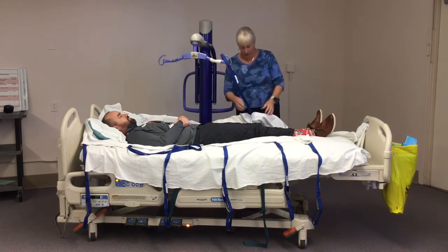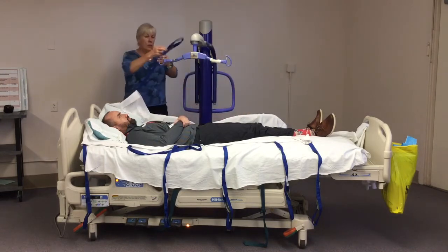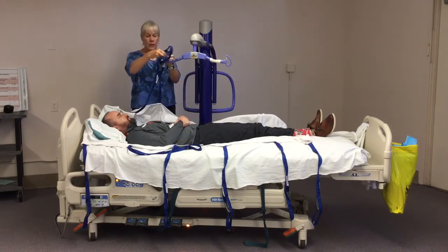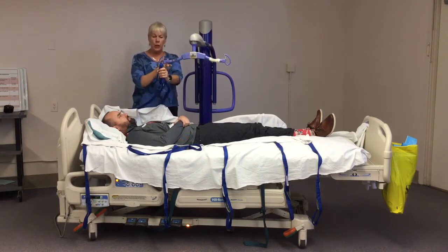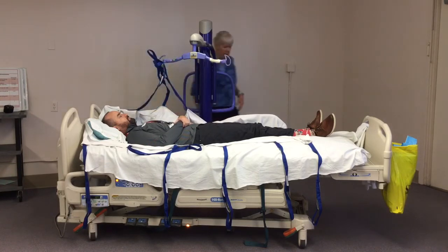The other thing, okay? Starting from the top, let's try, and you're going to use all the same color when you're doing this technique. Make sure that those loops are in there very good. Make sure that this is secure. Again, you do the same thing. You start at the top, move through 1 through 6.